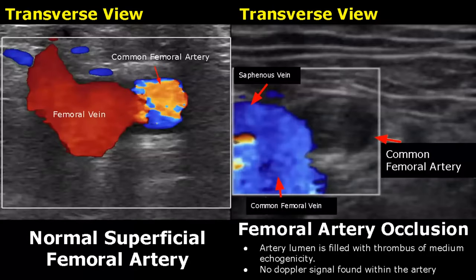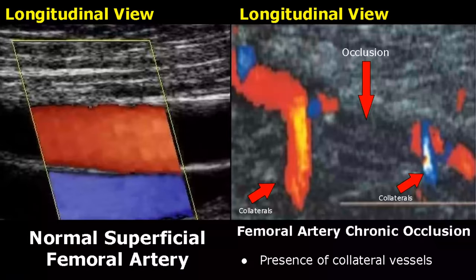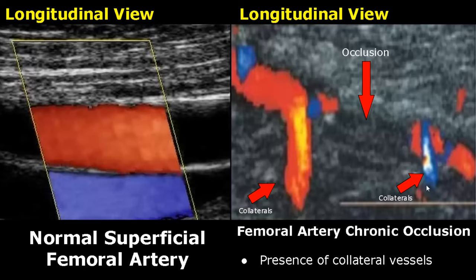In femoral artery occlusion, the lumen is completely obstructed with a thrombus of medium echogenicity. Blood flow is obstructed, so we do not see any flow within the artery and no Doppler signal is found. In chronic cases of occlusion, we will see collateral vessels around the occluded area. You can see these collaterals have formed, and this is the occluded area — indicative of chronic occlusion.